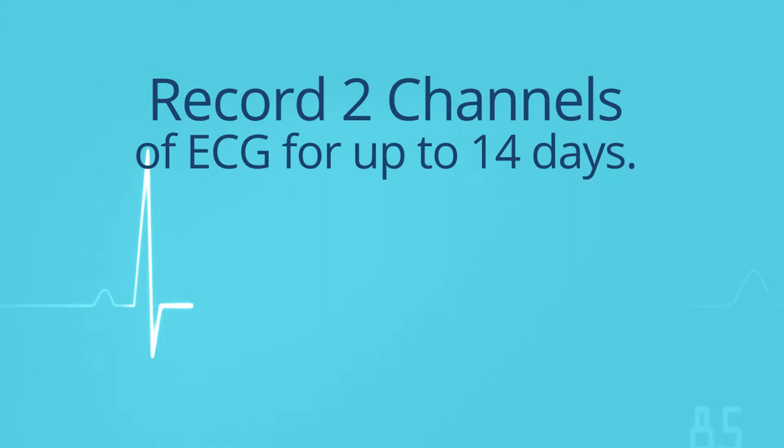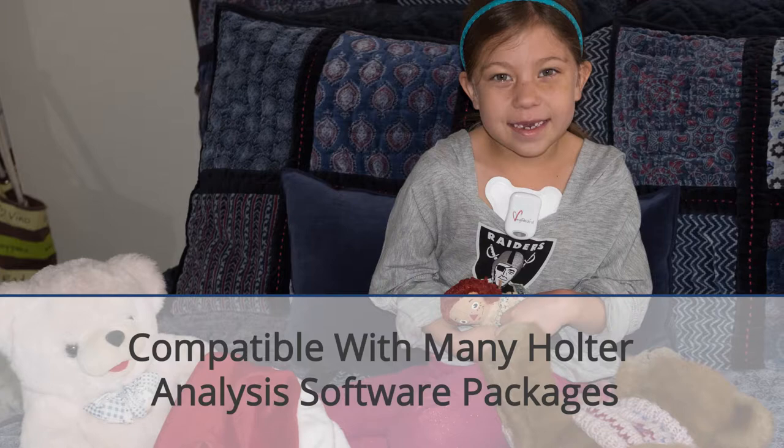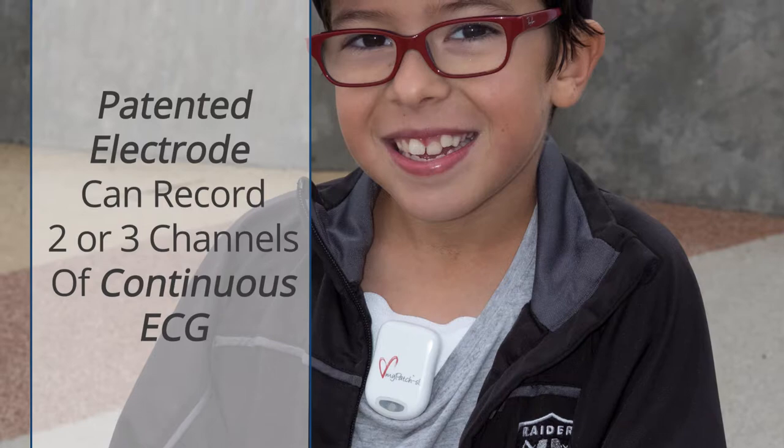Record 2 channels of ECG for up to 14 days with no need to change the electrode or recharge the battery. MyPatch SL is compatible with many Holter analysis software packages, and our patented electrode can record 2 or 3 channels of continuous ECG.